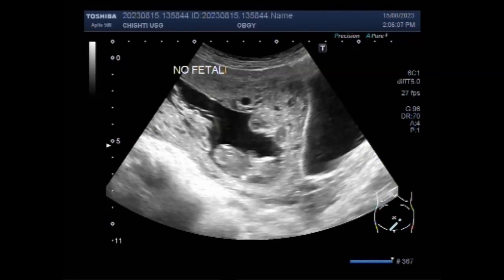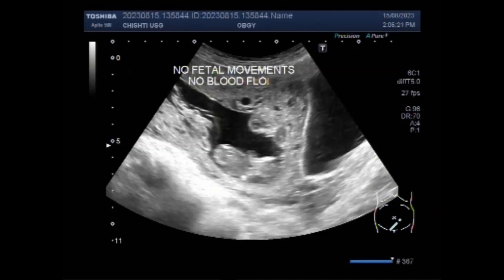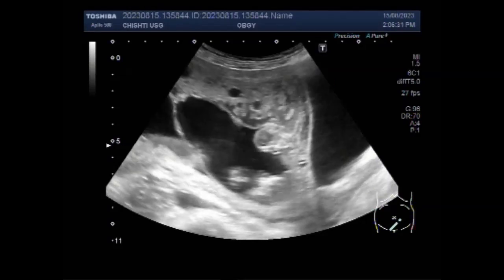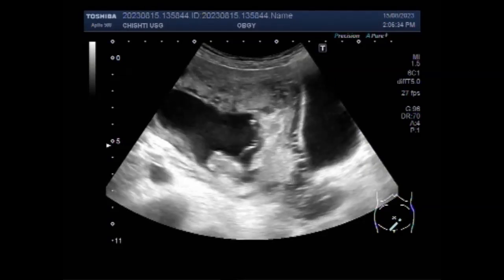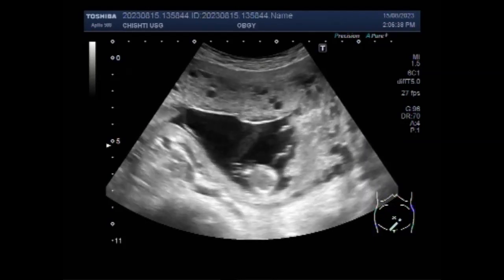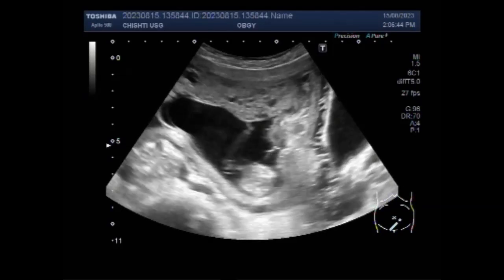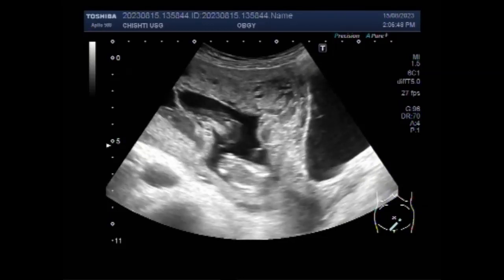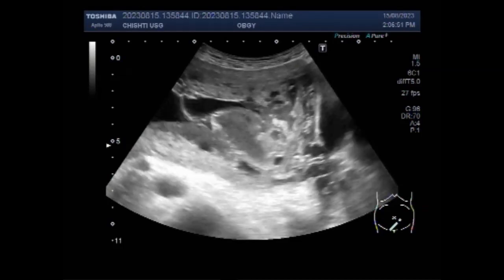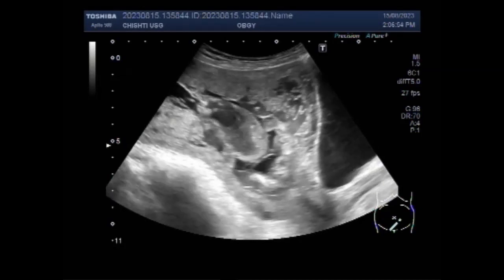Again, you can see the urinary bladder, the hydatidiform mole, and the fetus in the gestational sac. There are no fetal movements, no fetal blood flow, and no fetal cardiac activity is seen. Ultrasonographic diagnosis of a twin pregnancy with hydatidiform mole and co-existing fetuses is visible at the end of the first trimester.